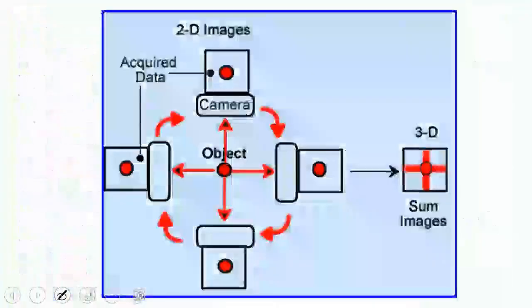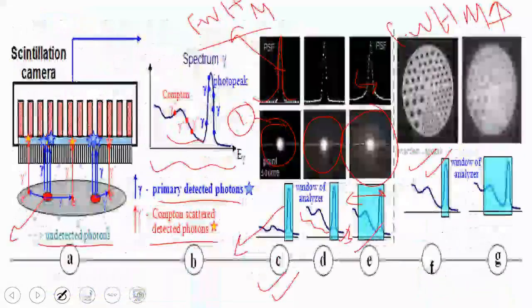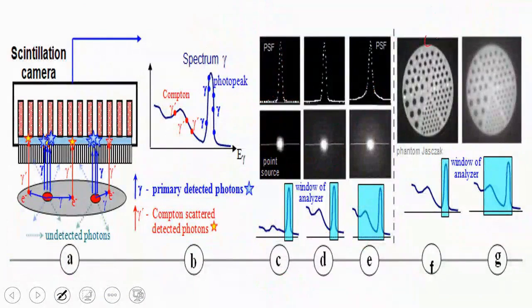Save this image. This image is a cross-section. I obtain this cross-section just like you take a helical scan and get a scout image. The scout image for us is as if you are taking an anterior or posterior view, similar to an X-ray image, right? It's a two-dimensional image, correct? So you are not taking a cross-section, right?